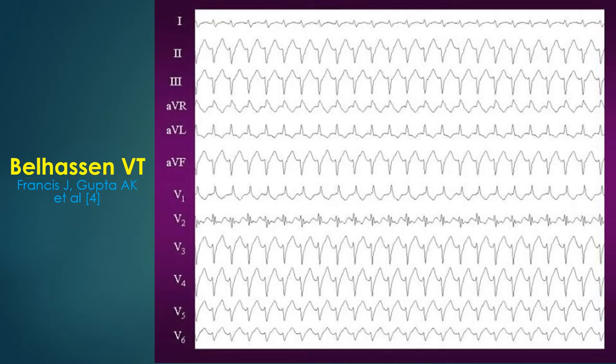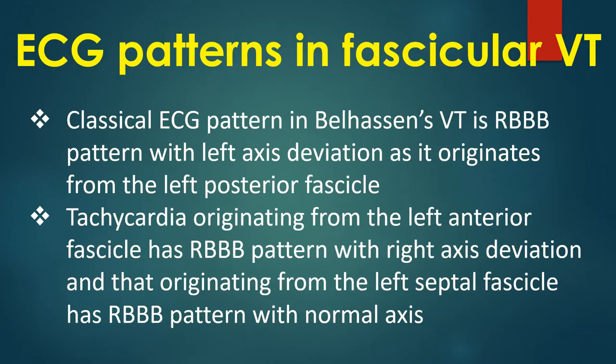12-lead ECG of idiopathic fascicular ventricular tachycardia shows the classical right bundle branch block pattern with left axis morphology, suggestive of posterior fascicular origin. Classical ECG pattern in Belhassen's VT is right bundle branch block pattern with left axis deviation, as it originates from the left posterior fascicle.